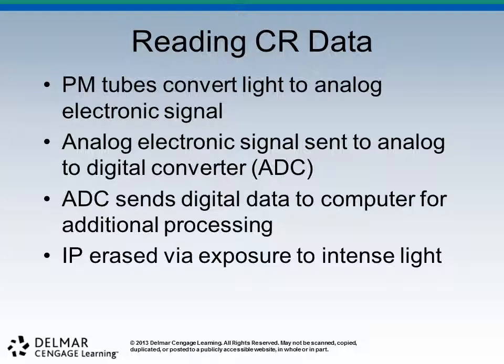This light is converted to what we call an analog signal, and that is sent and changed into a digital signal, so something called an analog to digital converter. Light is in itself, if you track with me, analog. It's a little bit on, maybe all the way on, and then back to off. Digital signals are on or off, right?